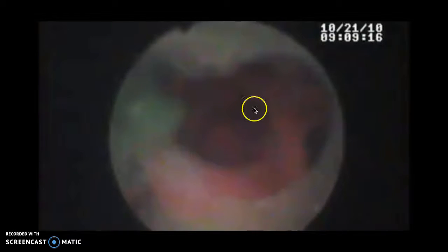But here we can see this material seeping down into this area where it's not supposed to be. And then there you see it, you cough it up and everything's opened up, and we get some more aspiration. We still have this material left over in this area here, and it's still lingering. So that puts you at risk for issues with swallowing, like I said, aspiration, because we want everything to go back into this area over here.